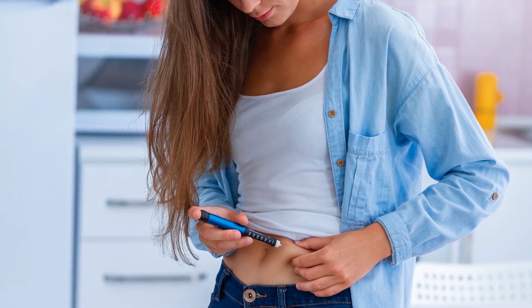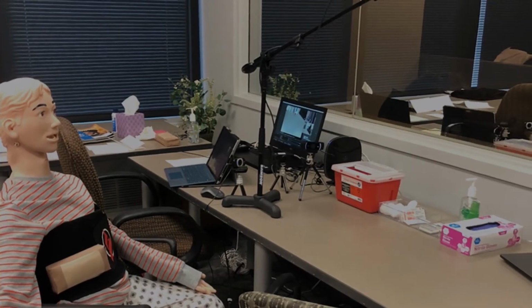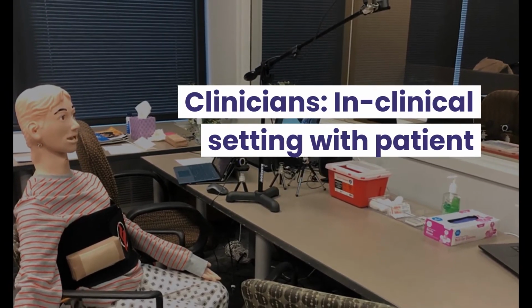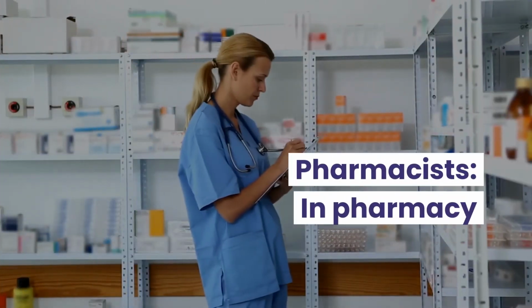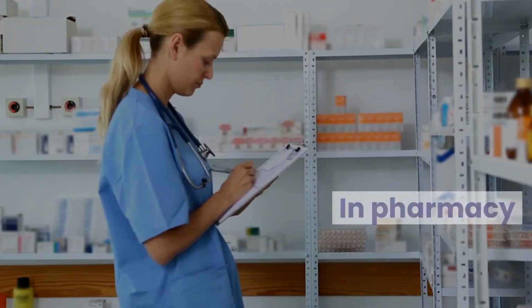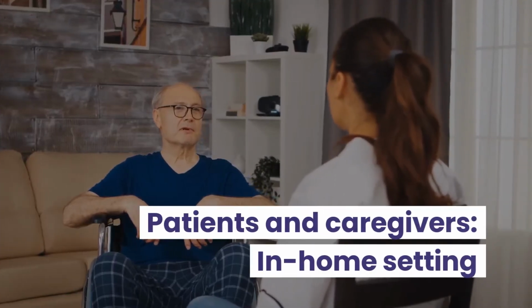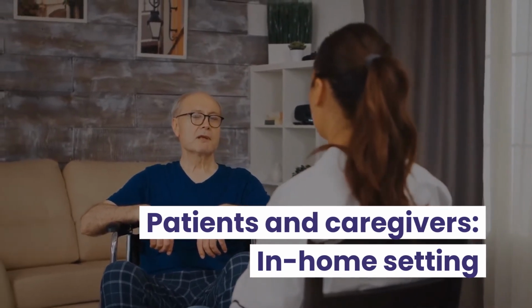Each user group operates a device in different use environments, requiring different simulations to encourage realistic behavior during testing. A clinical setting might include using a mannequin as a patient with access to their typical clinical supplies, such as gloves and alcohol swabs. If testing with pharmacists, mock up stock shelves, pharmacy bags, prescription labels, and consider testing with dyads, both pharmacists and technicians in the same session. If testing patients and caregivers using an in-home setting, an injection pad can be placed on the participant's or mannequin's body for realistic device positioning.